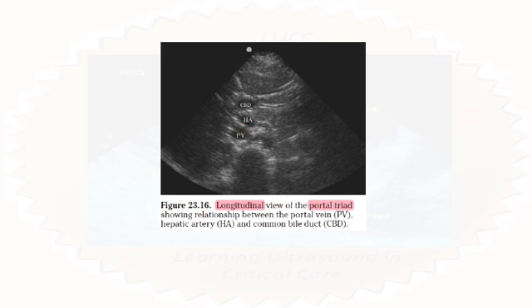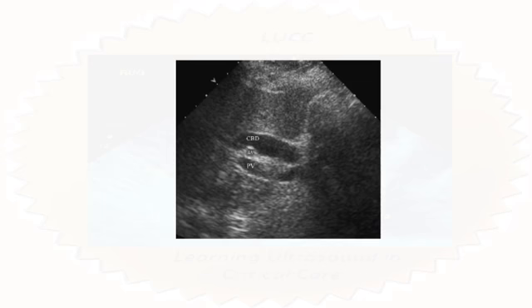However, apart from this subjective analysis, this is another example of a dilated CBD. So once again, what you see is in comparison with the adjacent portal vein, the CBD here is bigger. Okay, it's about 1.5 times the size of the portal vein, and if you measure the inner edge to the inner edge, I'm sure it will be more than the normal of 5 millimeters, but it's probably going to be about a centimeter or so.